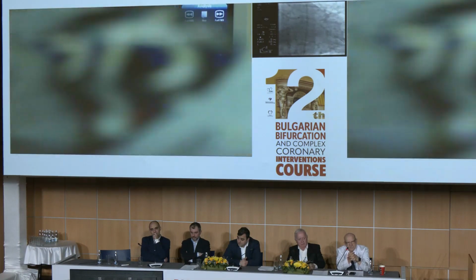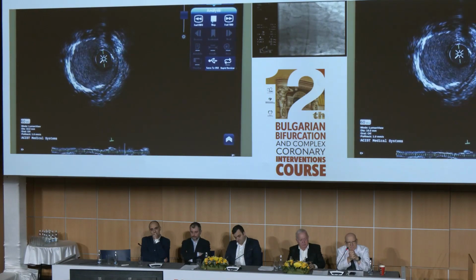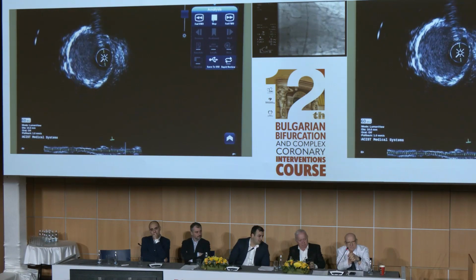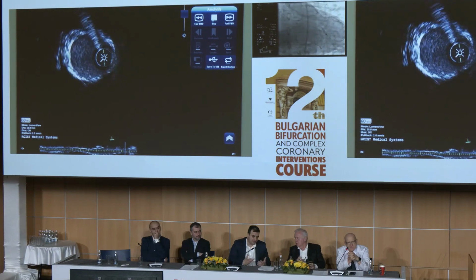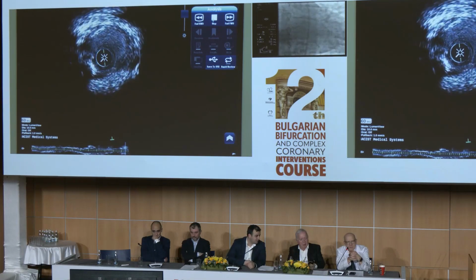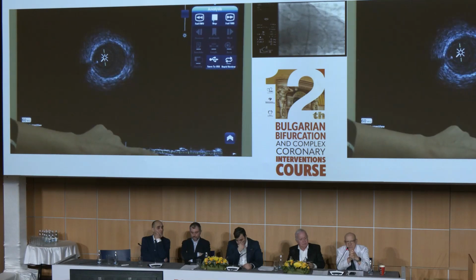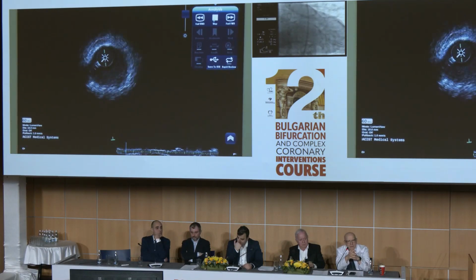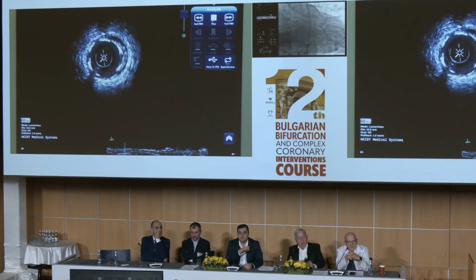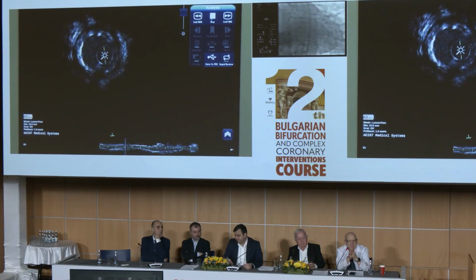This part of the vessel, okay, but nice. So she's nice. But what I see from here, you have some malposition distally that you are correcting now. Yes, this is why I'm doing what I'm doing now. This is a 2.5 balloon at higher pressure. Just to correct, compliant or non-compliant? This is the question. No, I'm joking.